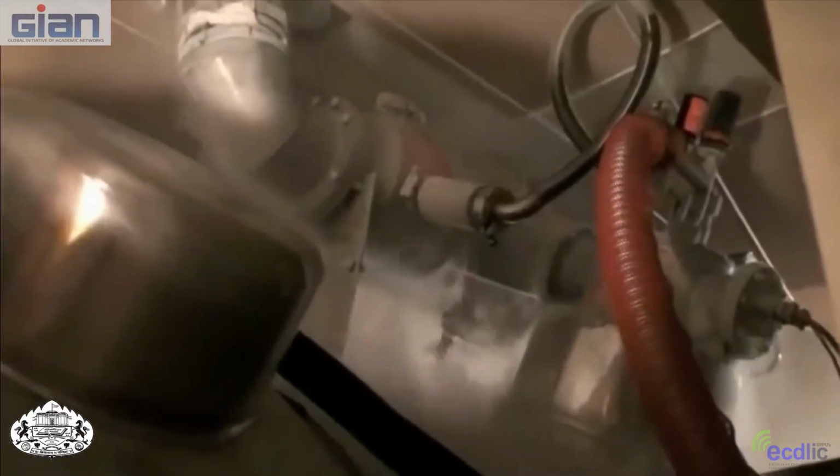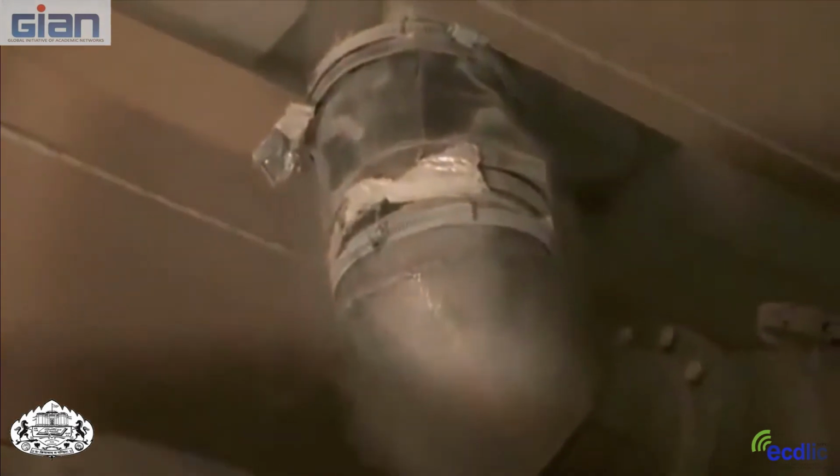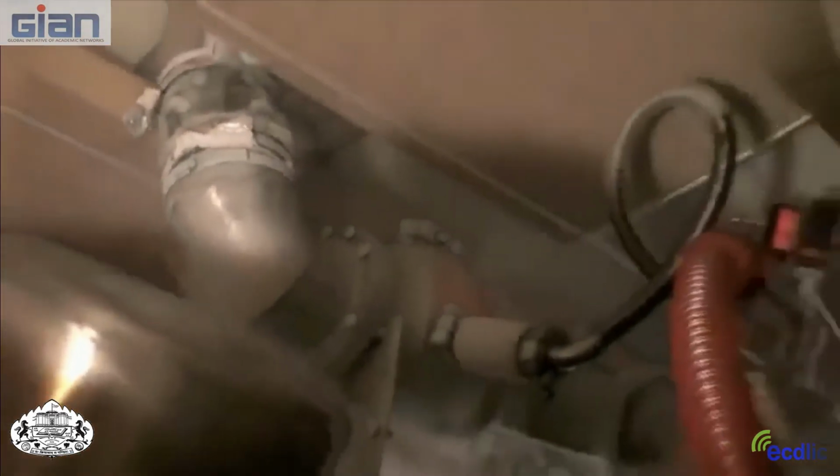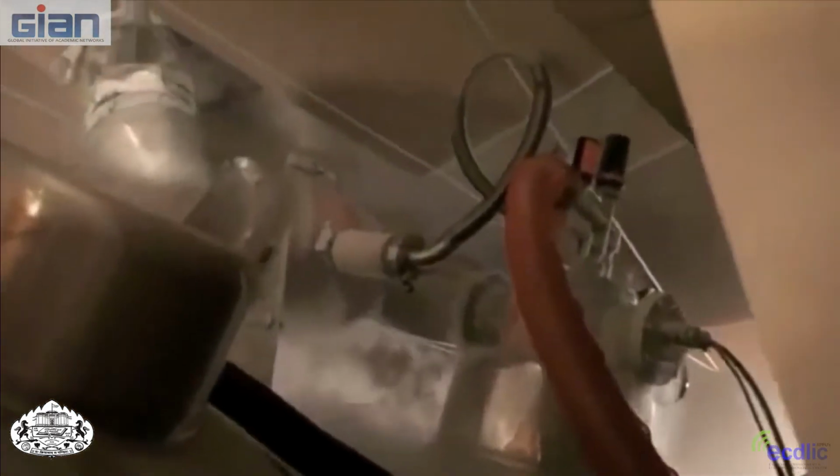Oh, it's liquid oxygen, liquid nitrogen. It got cold enough to actually, yeah, it's liquefying on the steel. You hear it, it sounds like it's popping. Oh yeah, that's liquefied air. It's all coming down. Yeah, you burn yourself big time if you get near that.